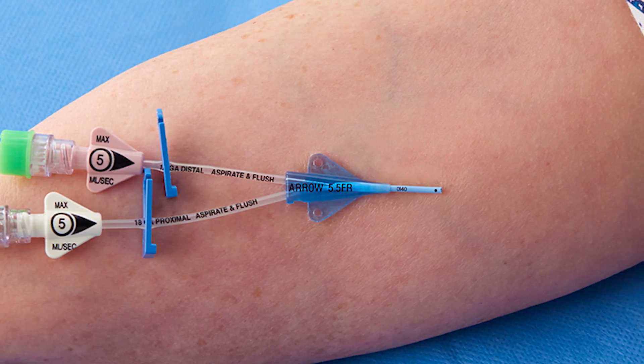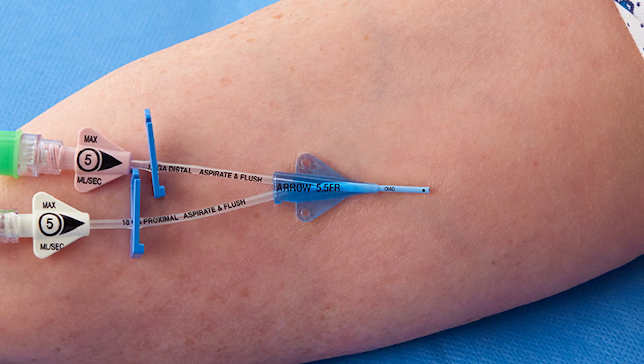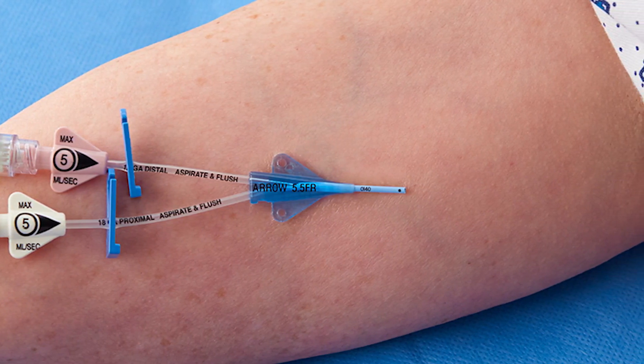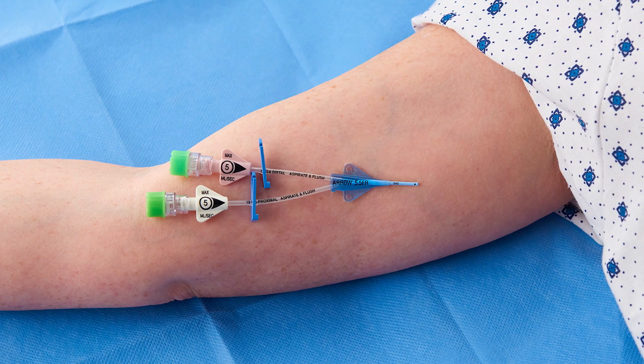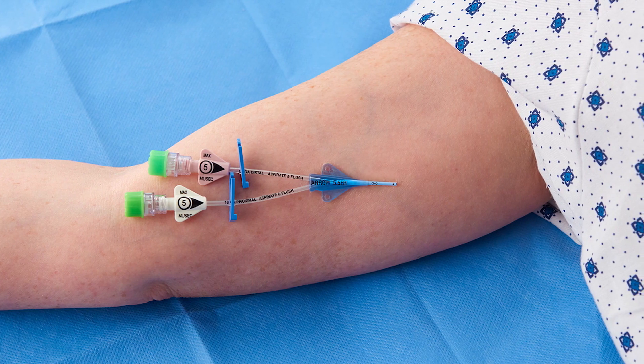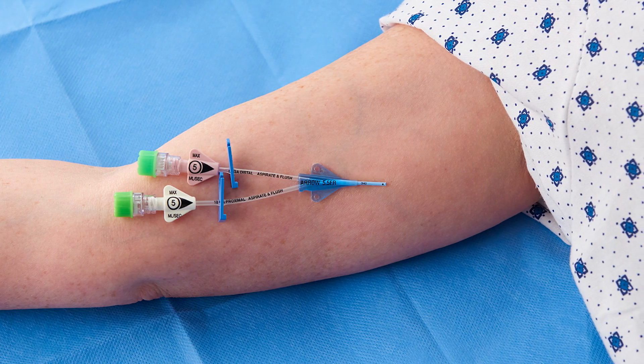Clipping hair at the site may improve dressing adhesion, but shaving is not recommended as it may create small abrasions on the skin which could lead to complications. Allow all antiseptics and skin protectants to dry completely before applying Tegaderm CHG dressing to ensure good adhesion and prevent skin irritation.